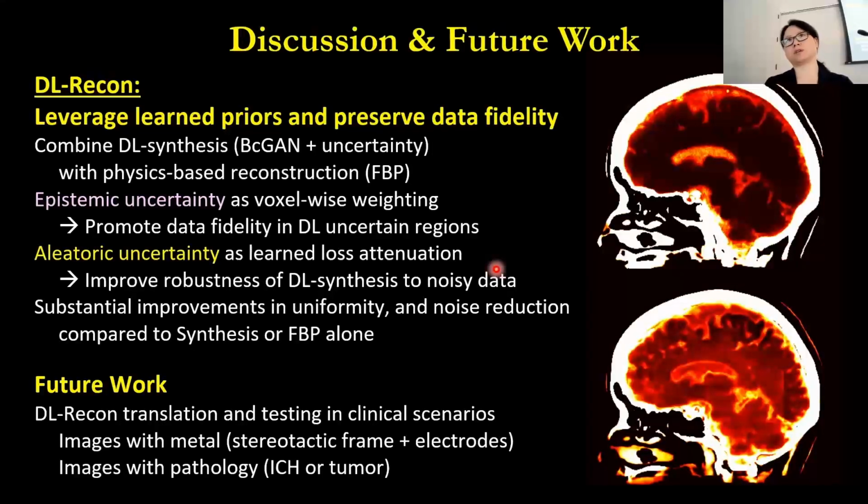Some of those corrections take another reconstruction or some estimation, so that comes at the cost of time and some kind of model. So here we try to keep it simple by just using an uncorrected FBP, and we show that it also works in a good way.